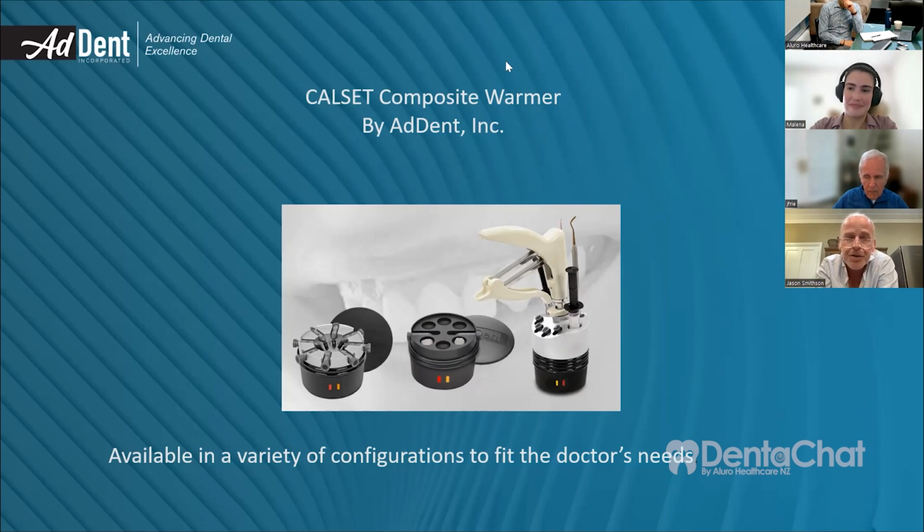The other advantage of using heated composite for an onlay is, particularly on the upper arch, on the maxillary arch, if you finish in the mid-facial or mid-buccal, whatever you want to call it, oftentimes you'll get a line where the transition is between the onlay, the ceramic, and the tooth. Now, most veneer cements are typically a little bit more translucent than regular composite. And because of that, you will often get a little tiny gray line where the ceramic meets the tooth if you use a veneer cement.